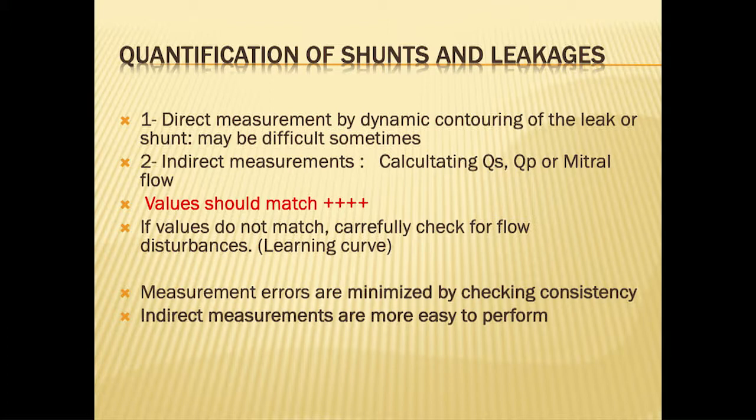There are many things responsible for flow errors in measurements. And this is, I think, the weakness of 2D flow measurement, because maybe you are used to measuring flows with 2D. Sometimes you make mistakes, but you don't know the reason for your mistake because you are not able to see the whole picture.